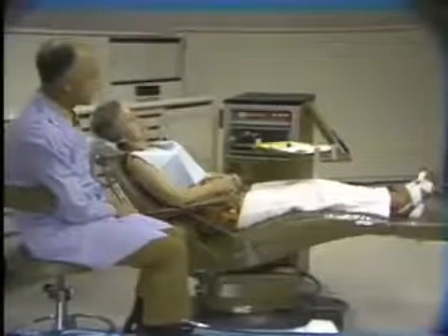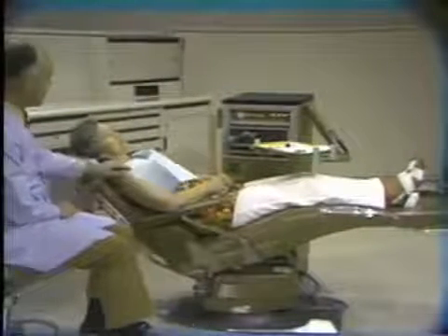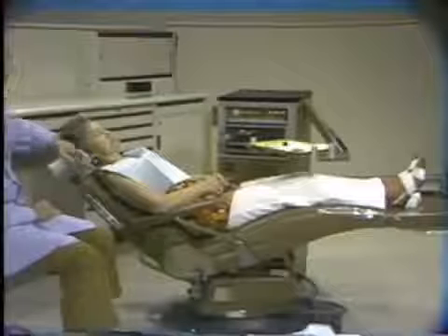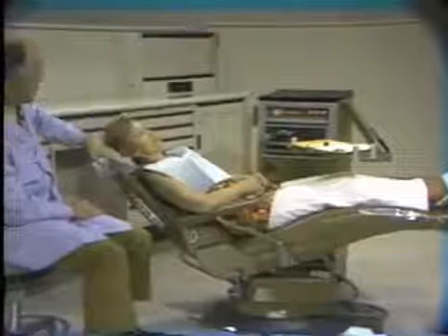I think at this time we'll bring in a patient to show you the relationships between operator and patient. When the patient has been seated, we can put the patient into position to do operative for the lower right quadrant, mandibular right quadrant. So again, we'll go back to the 1/2 tilt and the back down to about 45 degrees. The chair is already low to the ground. Now the patient is in position. You'll note that the head is in line with the body. Do not put the head back with the headrest. This will make it more difficult to see down into the lower right quadrant.